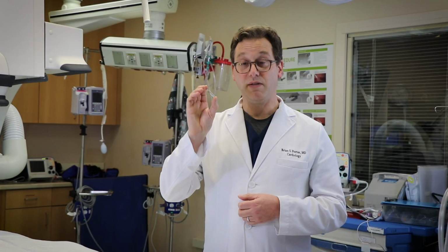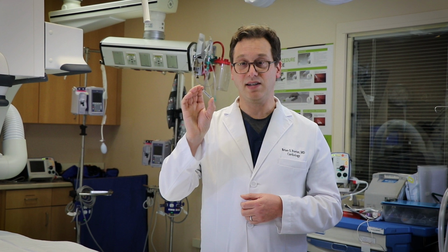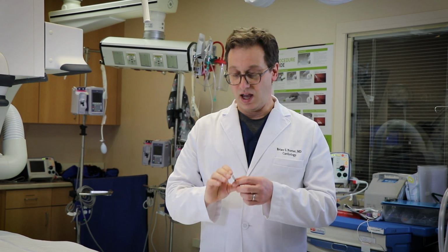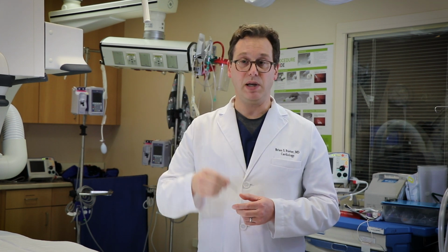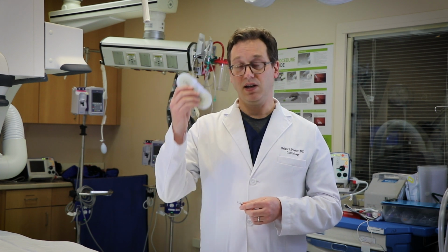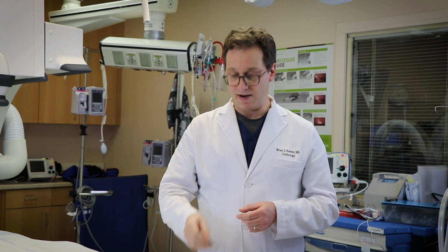We also have the ability to monitor this device in our clinic. We have a full-time registered nurse whose job it is to analyze the signals that are being sent from these implantable loop recorders and from our pacemakers that I'll talk to you about next. If the loop recorder ever senses that the patient's heart rate is not quite right, then we'll be able to take action based on that information. So again, for someone who's having symptoms that are very infrequent and can't be detected on a Zio patch like this, sometimes we'll insert a loop recorder under the skin.